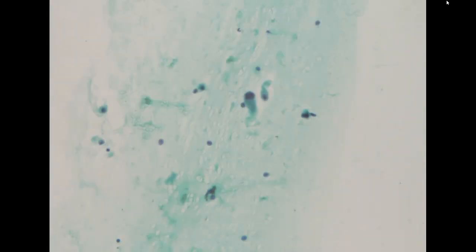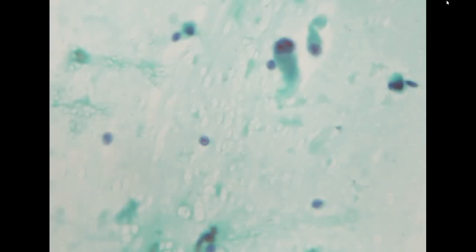Here we have some single cells, but with very, very prominent nucleoli.